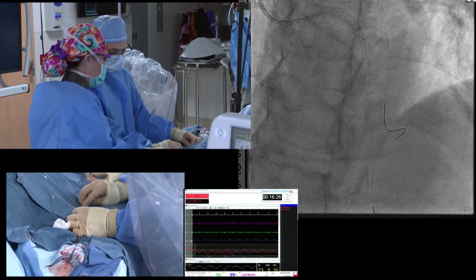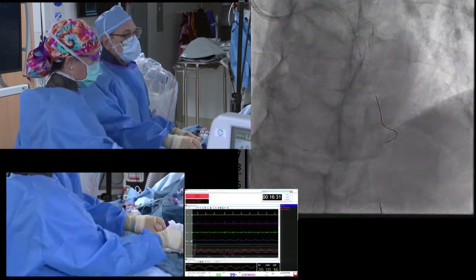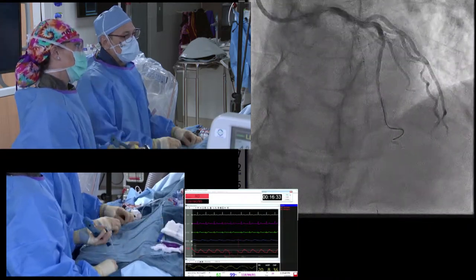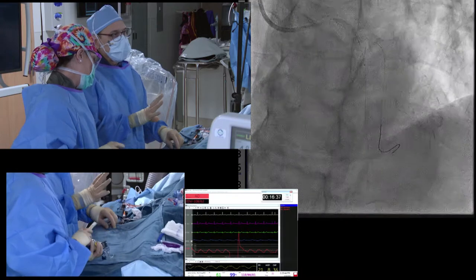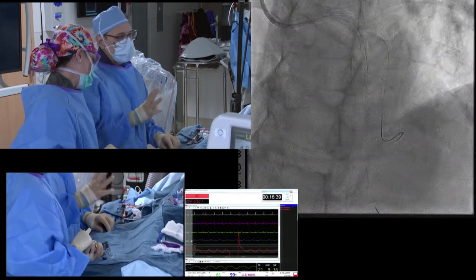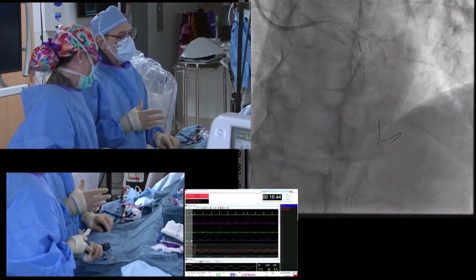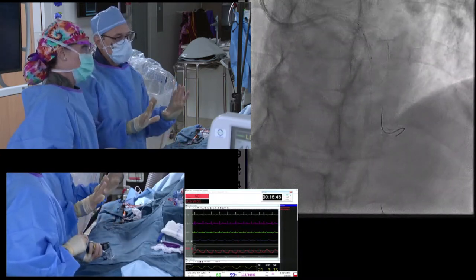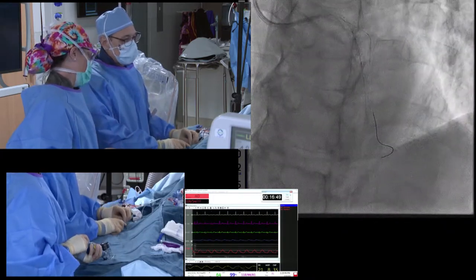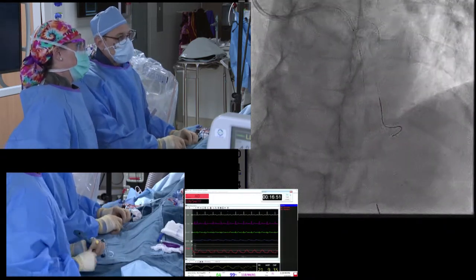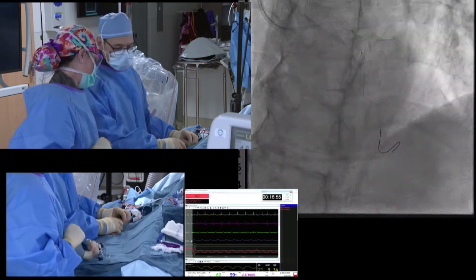The balloon is coming down to the site of the lesion, right at the distal border of the LAD stent. I don't want to over-dilate — I'm just going up to 4, 6, 8 atmospheres to restore flow so we're in a stable situation and can do OCT.